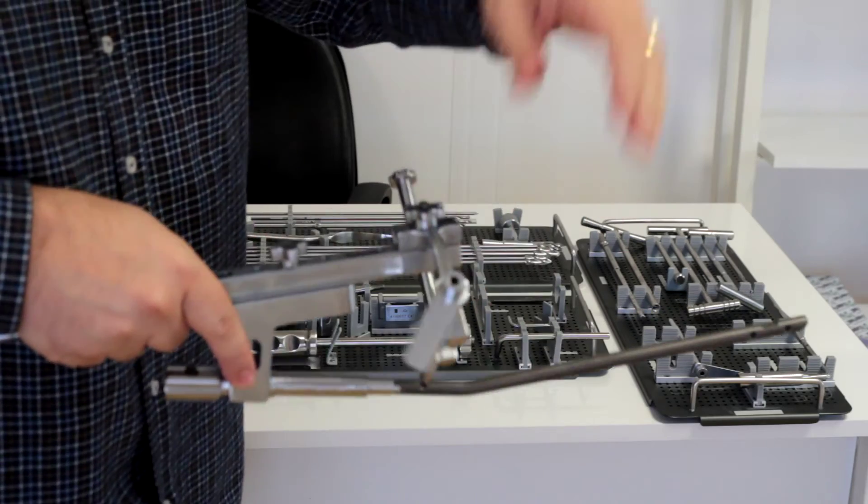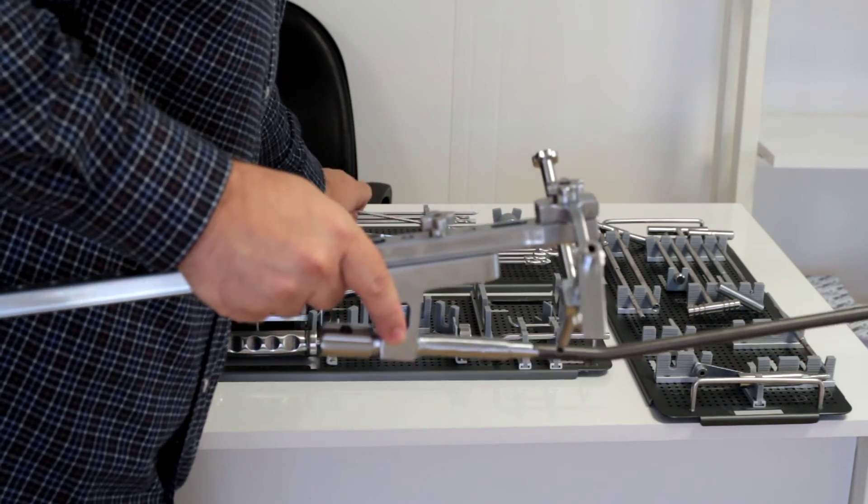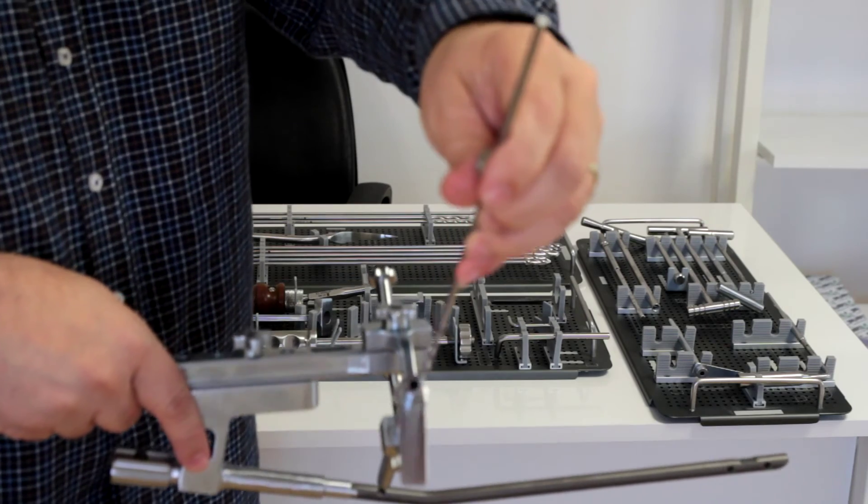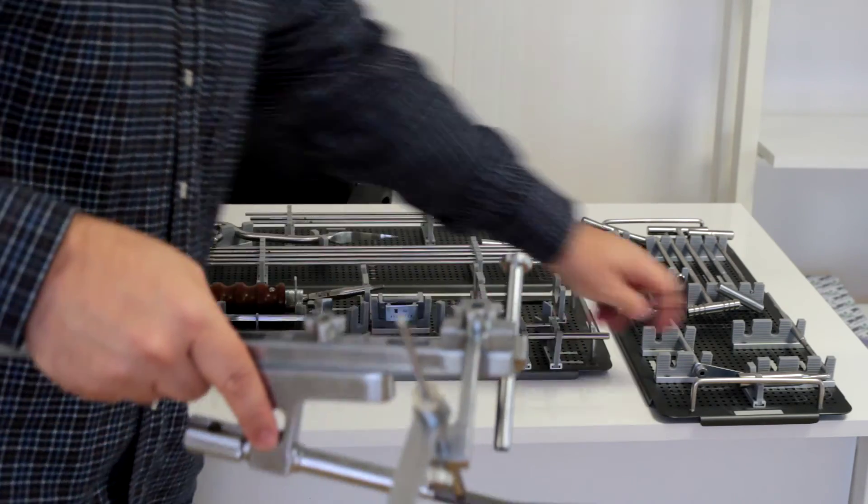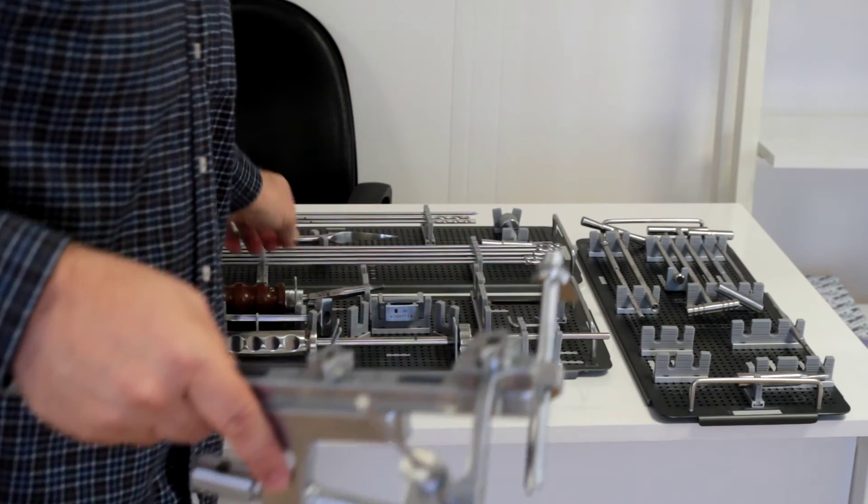Now it's replacing the sleeves. Understand there is no need to press on there, it will directly go through the holes.